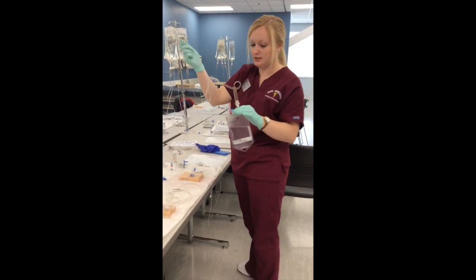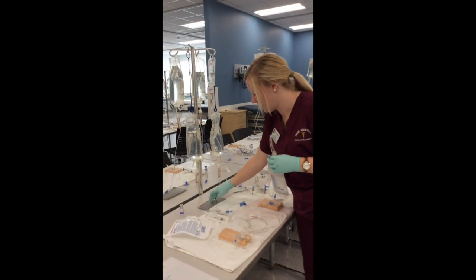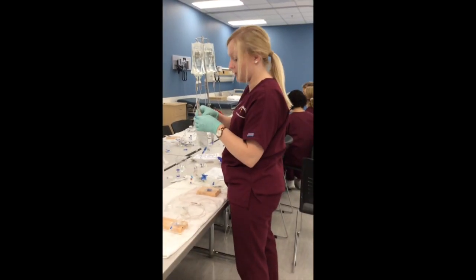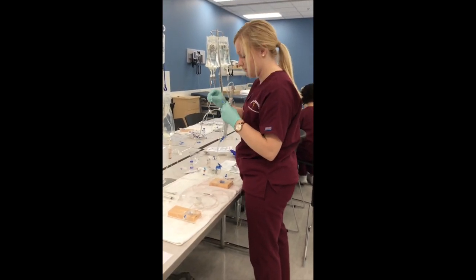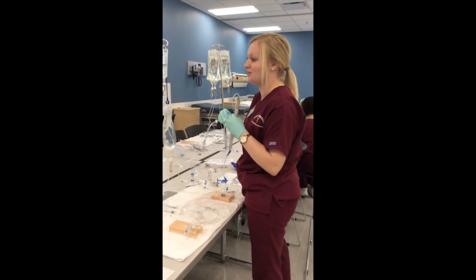Okay, and it is clamped, so I'm going to find the port closest to the IV bag. Here it is. I'm going to clean it for 30 seconds. I'm not gonna clean it for 30 seconds in this video, Holly. Just talking to you in the video.